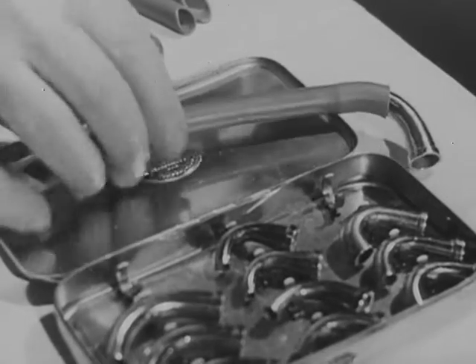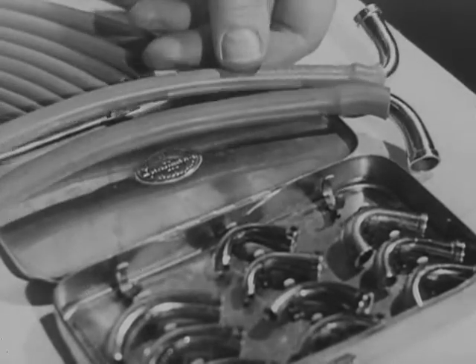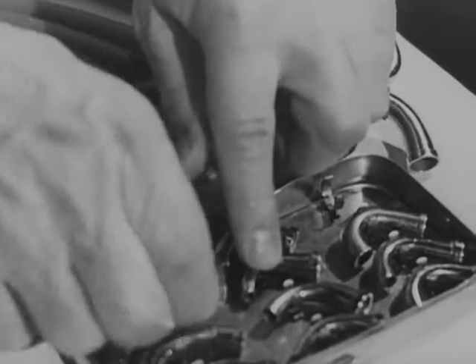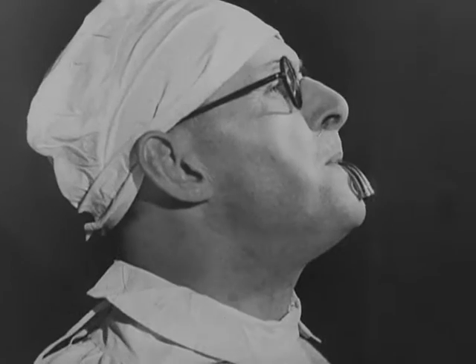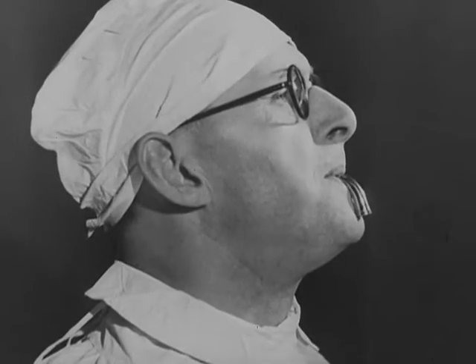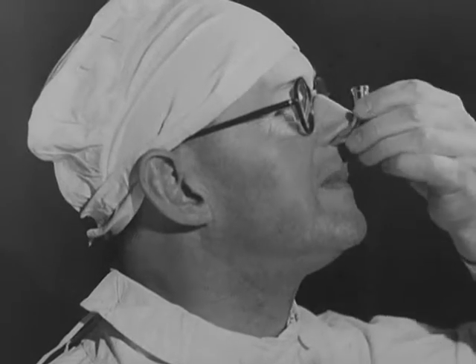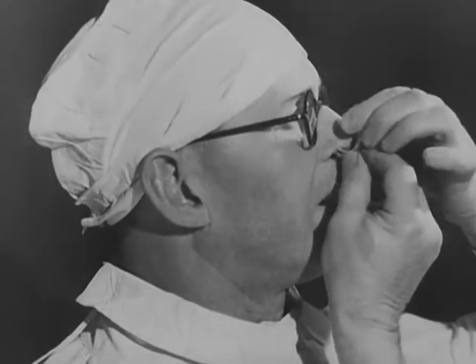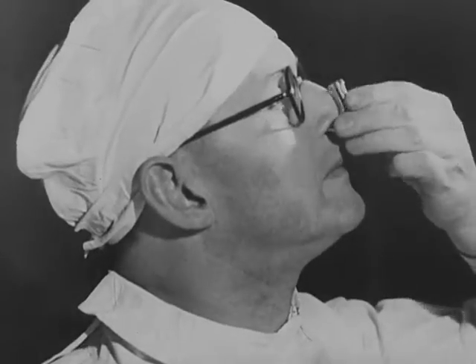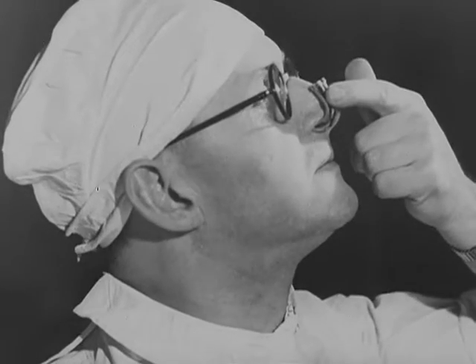Lastly, a series of metal connections graduated to fit the different sizes of endotracheal tubes. There are two types, oral and nasal. The oral type is a wide angle which fits snugly to the chin, and it is long enough to prevent the rubber tube being bitten by the patient's teeth. This type should never be used in the nose, as it would project too far and tend to cause kinking of the rubber tube when the towels are applied. The nasal connection, on the other hand, is a sharper curve and projects as little as possible from the patient's nostrils.